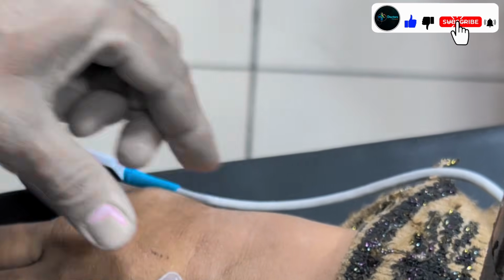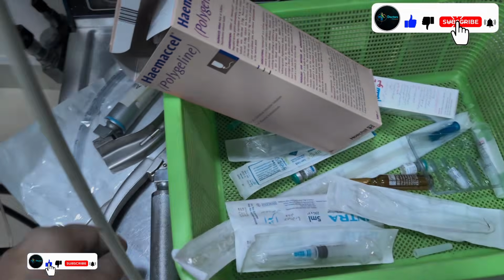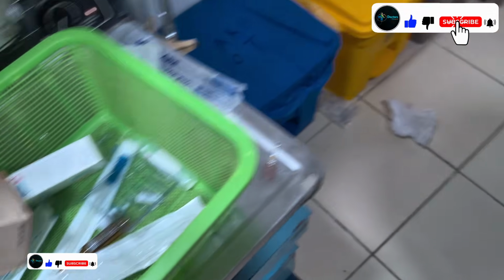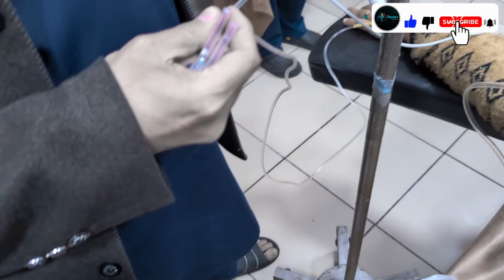First we will put an IV line. As you can see, we have already placed the IV line in the patient. Now we will fix the IV line properly. This is our medicine tray. As you can see, we have prepared the medicine.